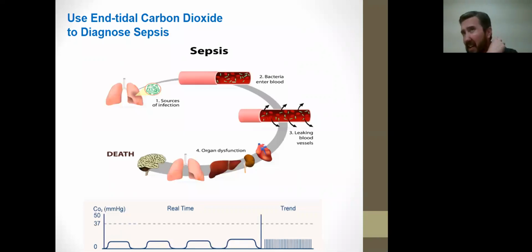So early identification of sepsis is the best opportunity that patient is going to have for aggressive therapy to improve survival, right? So end-tidal CO2 can be utilized as a pre-hospital screening tool or for intrafacility transport. Now remember, most of these screening tools rely on point-of-care testing, suspicion of the infection such as the systemic inflammatory response syndrome criteria, and point-of-care serum lactate levels, but it is possible to screen for severe sepsis without depending on these costly devices and time-consuming blood draws if they're not readily available to you.